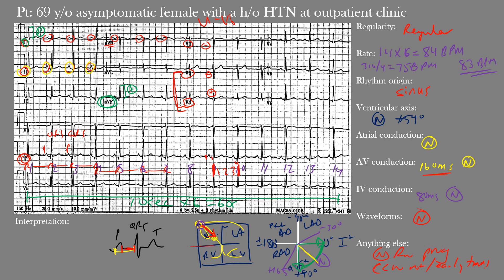Our final interpretation: regular rhythm with sinus origin, rate of 83 beats per minute, normal ventricular axis, normal atrial, AV, and intraventricular conduction, no abnormal waveforms, and R-wave progression and transitional zone generally within normal limits. This EKG shows normal sinus rhythm. Great job if you were able to get that on your own. In conclusion, our 69-year-old asymptomatic female with a history of hypertension has an EKG showing normal sinus rhythm.